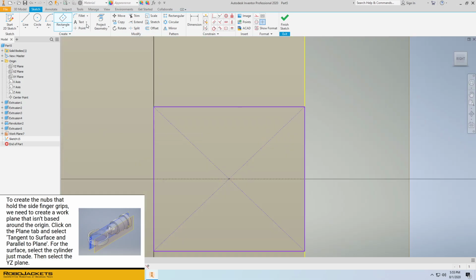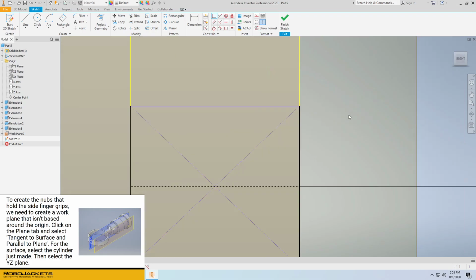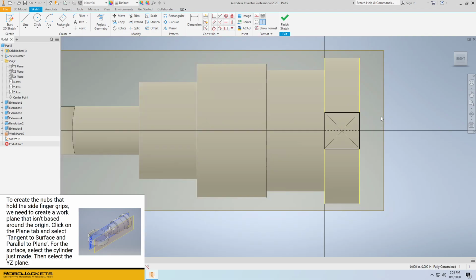We know we want the corner of our square to be coincident with the bottom of the cylinder. Same with the top of the cylinder. With these two constraints, we can set the sides equal, creating a square that is dependent on our two parameters in the same way that the cylinder's height was, without having to do all the calculations once again. We'll finish up this sketch now.